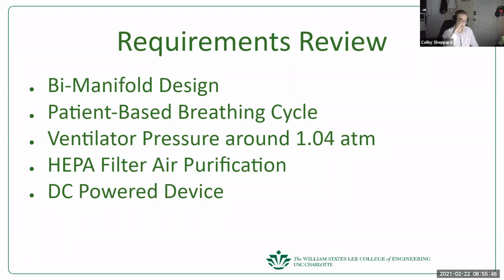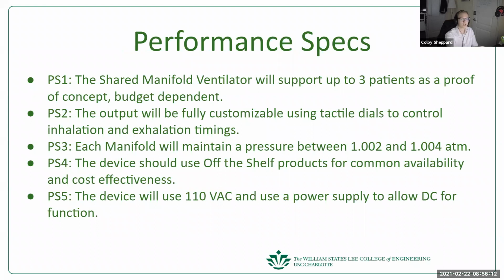All of the air going to and from patients is going to be HEPA filtered just to keep as much contamination out as possible. And then it's going to be a DC powered device. It's going to be 12 to 24 volts, depending on the devices, or rather 5 to 24 volts because of the Arduinos and stuff. And then here we have the performance specs.